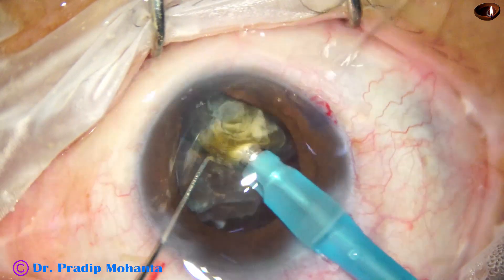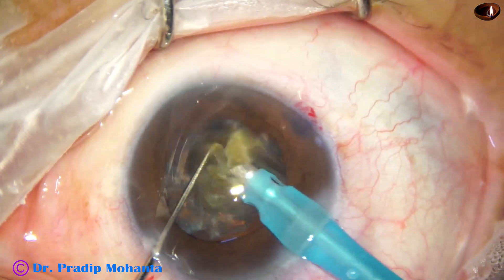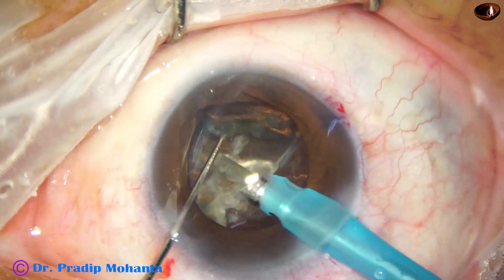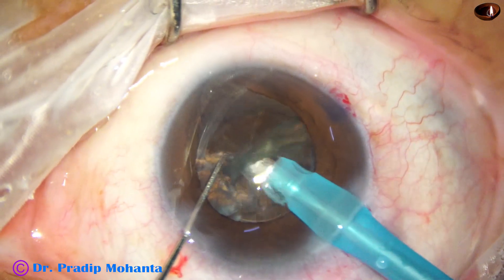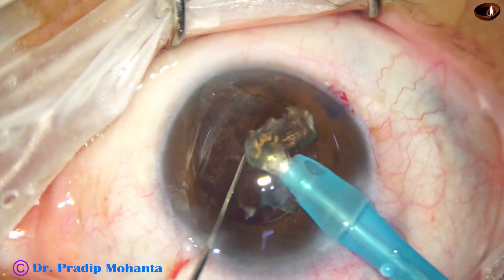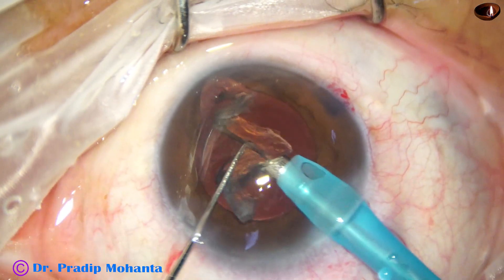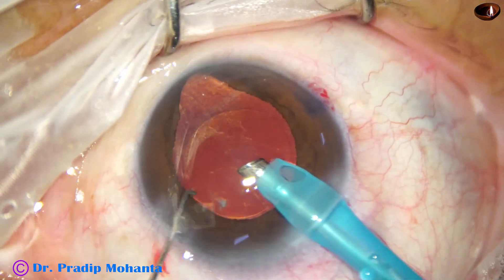At this time, I am trying to peel off the epinucleus and remove the nucleus. And finally, with low vacuum and low flow rate, I remove the epinucleus. The nucleus has been nicely managed.